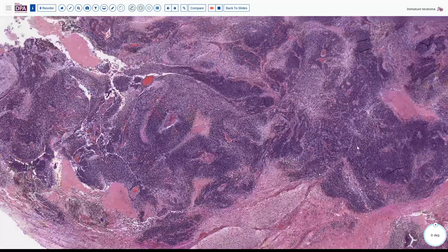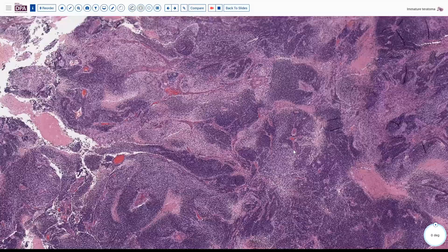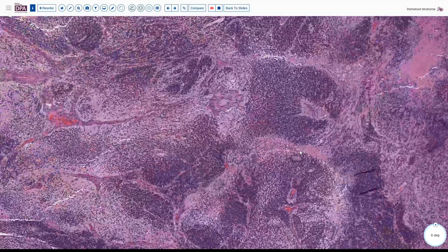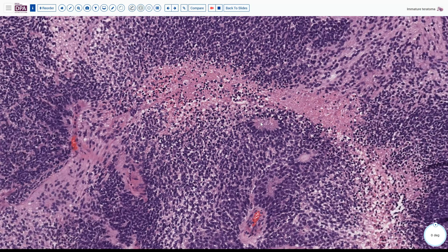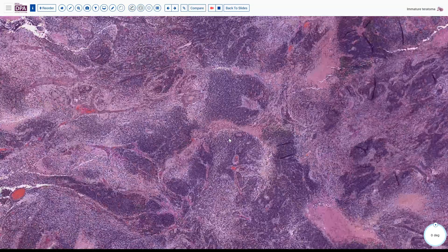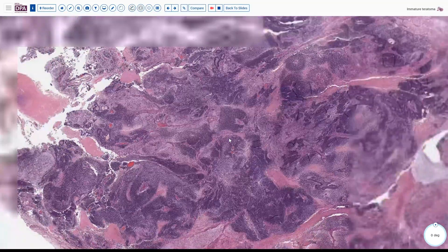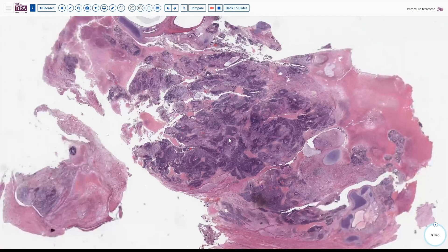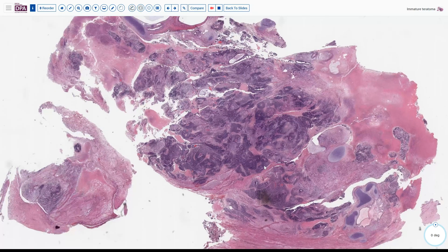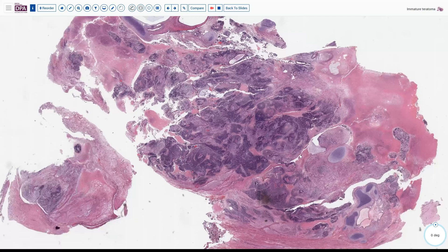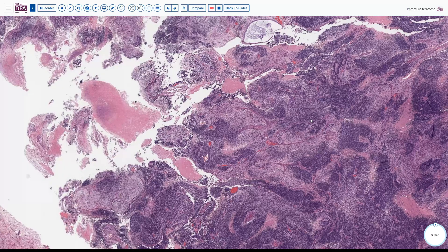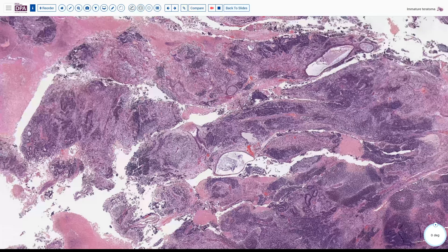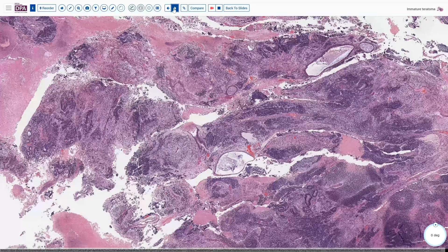This appearance — this kind of tissue in this sample — immediately pushes us into the diagnosis of immature teratoma. Here again are more of these tubule-like structures with rosetting around a central fibrillar core. That establishes the diagnosis. The next question becomes grading. We're looking at 1x or 2x magnification here, and the grading system is based on a 4x low power field. We're certainly at three or more on this slide with significant amounts of immature tissue, so we would move this into the highest risk category.